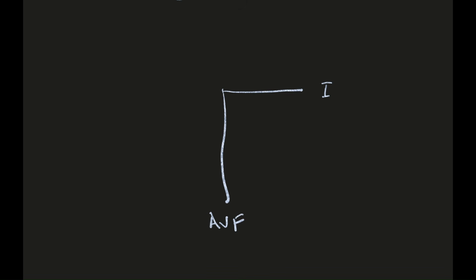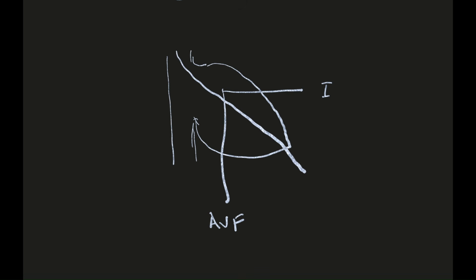You all remember the normal axis of the heart. If I'll draw the heart, please forgive me for my bad drawing. Let's say it is the heart. It is more like a pear, less like a heart. But still, for example, this is the heart. The axis of the heart is between lead 1 and AVF, right? This is the normal axis of the heart. In the normal heart, the current will always flow in this direction.